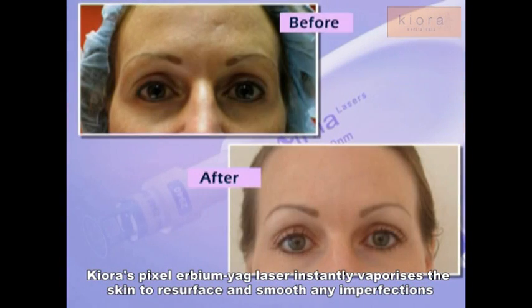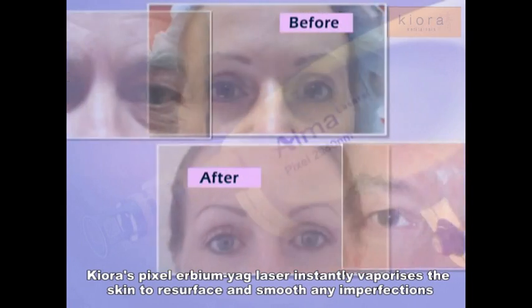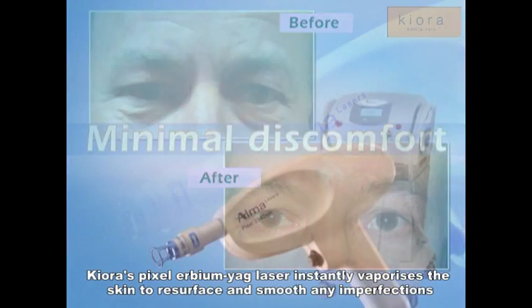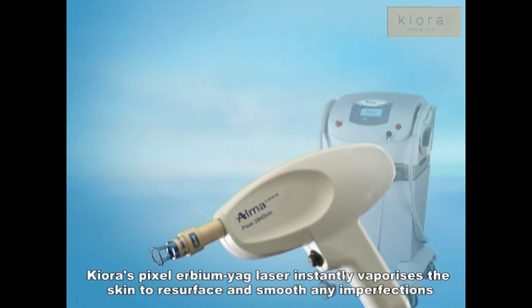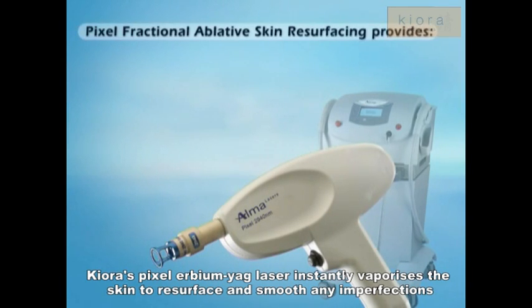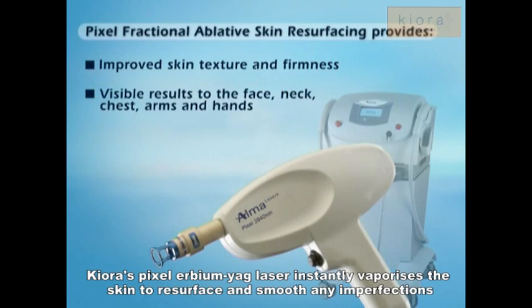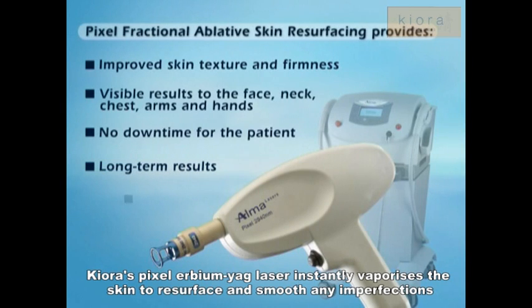In addition, the minimal depth of penetration of the Pixel multiple beams results in minimal discomfort to the patient. Pixel fractional ablative skin resurfacing provides improved skin texture and firmness, with visible results on the face, neck, chest, arms and hands. There is no downtime for the patient, with long-term results — all with minimal discomfort.